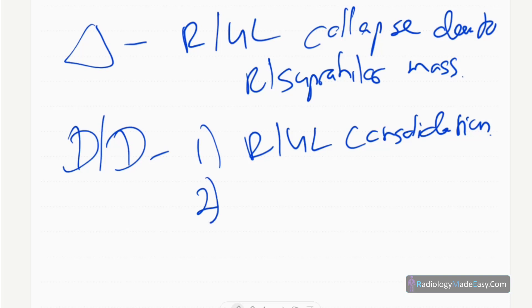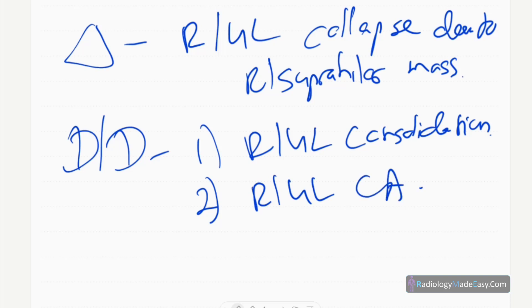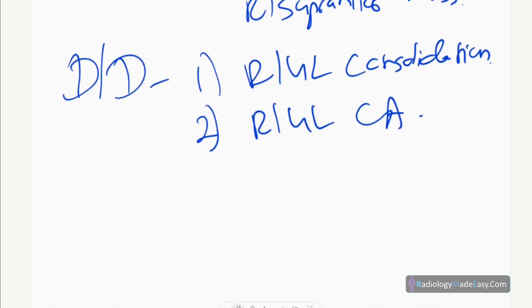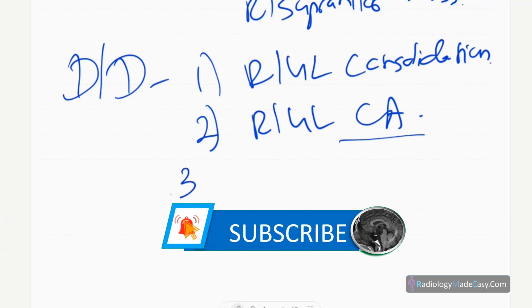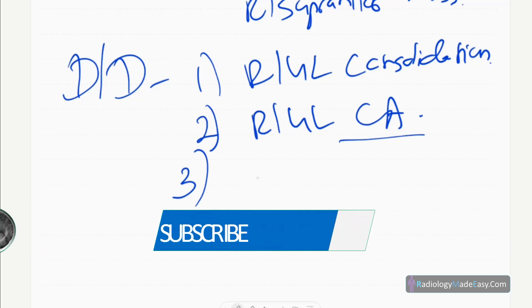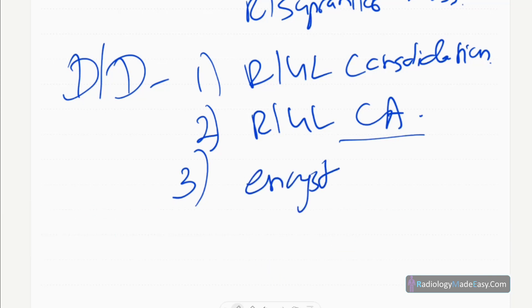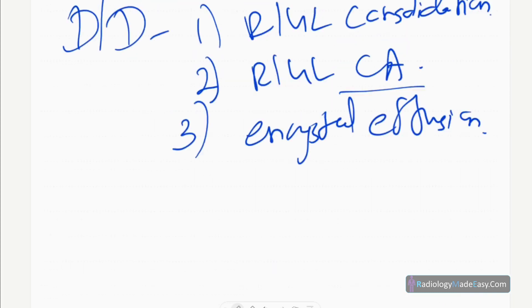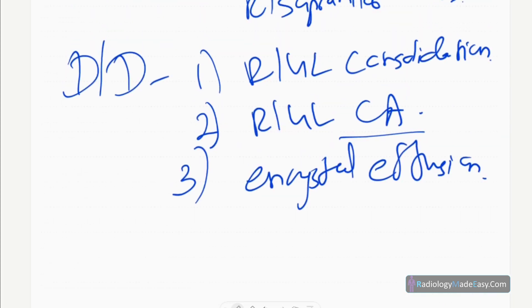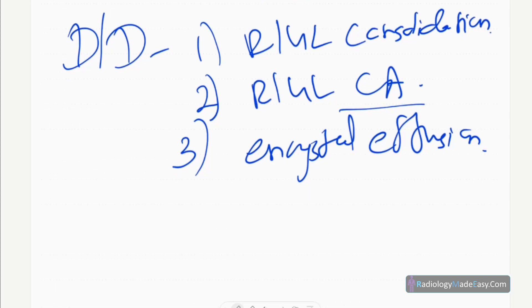The second differential is right upper lobe malignancy or Pancoast tumors, which also show mass effect. Third is encysted pleural effusion — encysted pleural effusions can also mimic this appearance; however, in effusions there is expansion of the lesion with no evidence of volume loss usually.